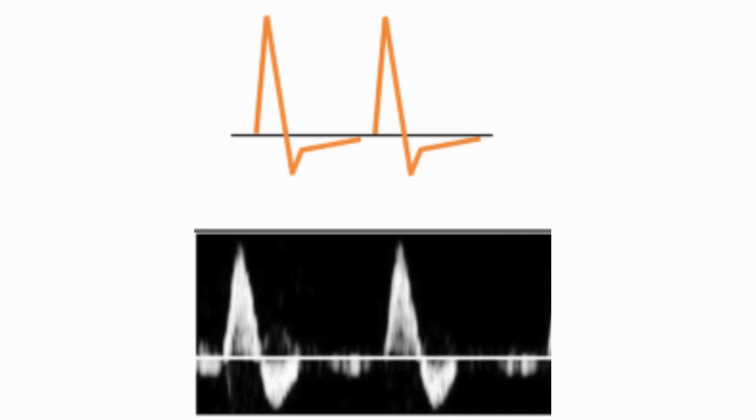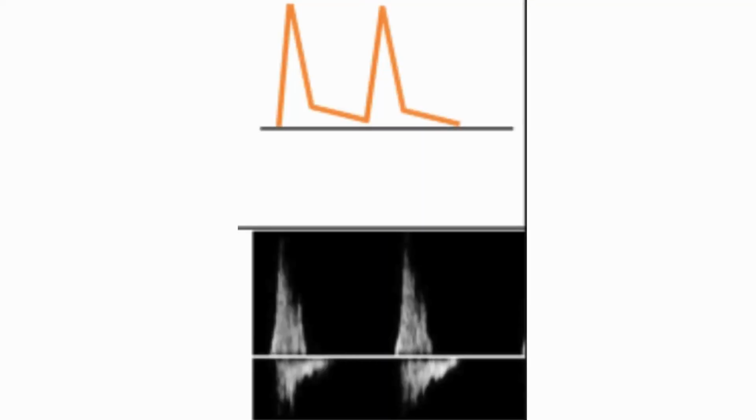A biphasic sound is slightly less healthy. You'll hear 2 phases, still okay, but maybe early disease. Monophasic is not good. You'll hear 1 weak, prolonged sound. It's dull and drawn out, like a breath that never fully exhales. Monophasic flow means there's significant narrowing or blockage. This patient might need vascular referral ASAP.